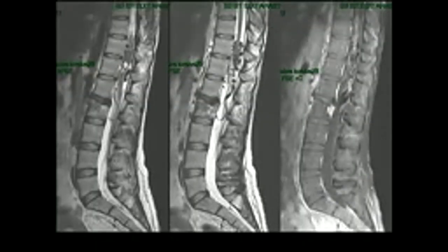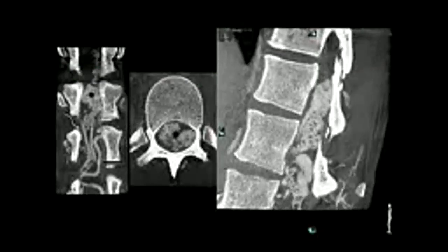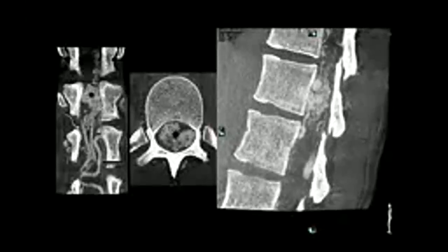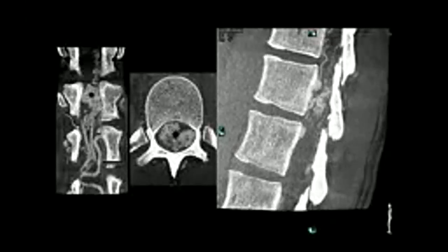And another one, it is obvious that in these nidus, it is impossible to have a total cure. And this is not our aim. What is our strategy in this group? If the patient already ruptured and that rupture point is visible, we work on it very carefully, selecting the feeding arteries, it is this here. And putting the catheter, do as much as possible, not trying to occlude totally. In this case, we really did well. And at this part, we don't force ourselves to occlude.